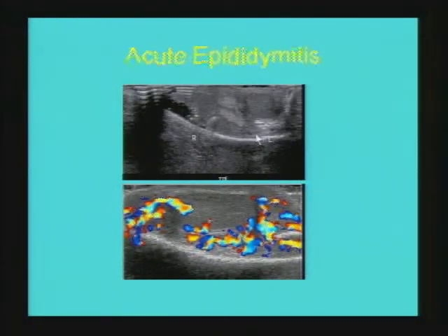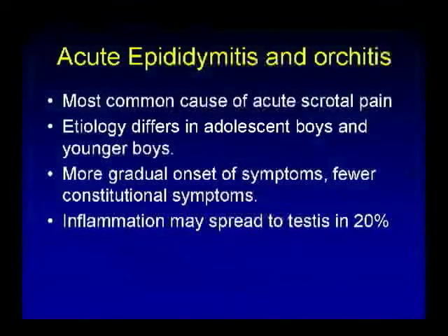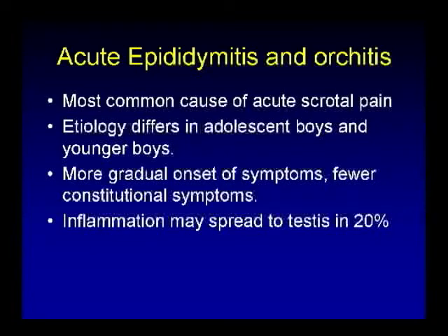The most common cause of acute scrotum in children is acute epididymitis. This transverse ultrasound at the level of the epididymis shows heterogeneous enlargement of the right epididymis. Longitudinal ultrasound with color Doppler shows diffuse increased blood flow within the epididymis with normal intratesticular flow — a classic example of acute epididymitis. Etiology differs by age group: infectious in adolescent and prepubertal age, and in younger children often due to a congenital abnormality such as an ectopic draining ureter. As compared to torsion, onset of symptoms is more gradual, with fewer constitutional symptoms, and inflammation is localized to the epididymis, though in 20% of cases it may spread to the testis causing orchitis.